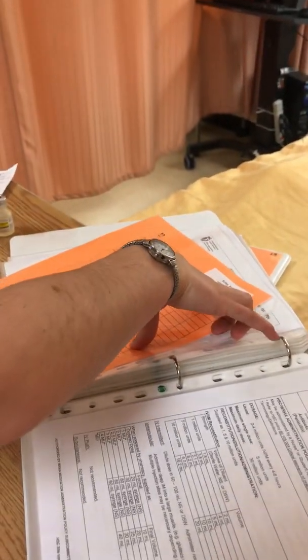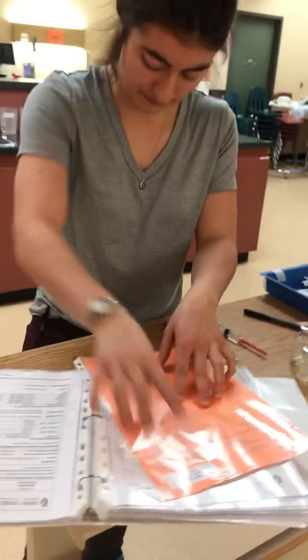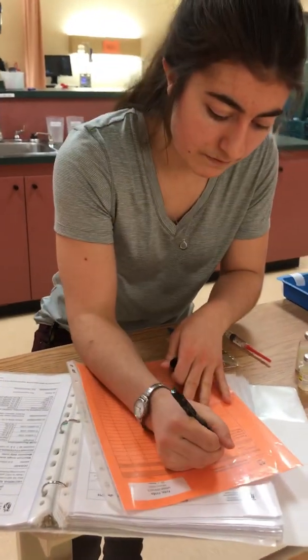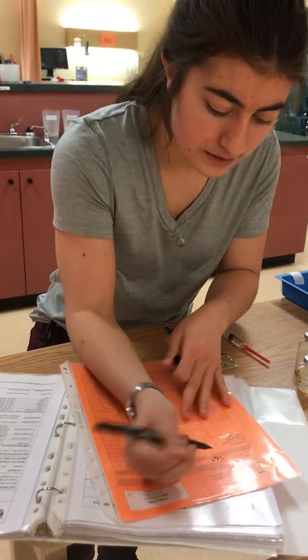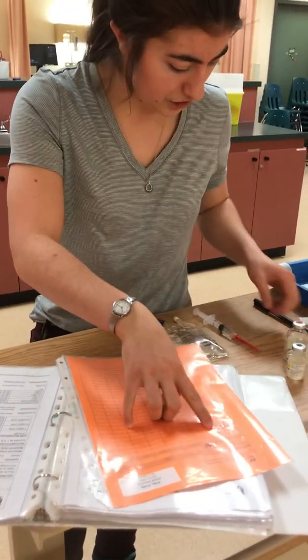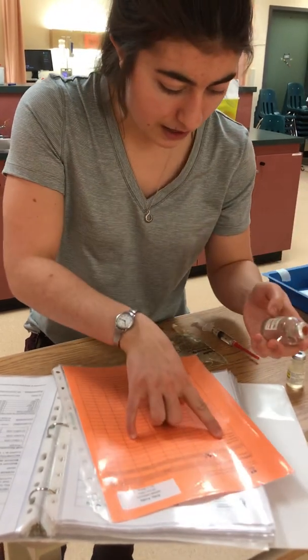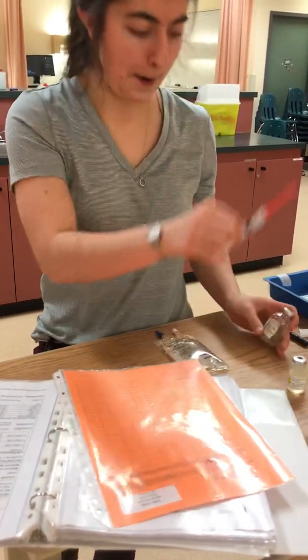Frida Fritz, FIN number 0991625. It's the 4th of June, 1963 for her, and Dr. J. Ames. 11th. That was the time I'm giving this one. Alright, so penicillin G sodium. I have my penicillin G sodium. I have 3 million units.